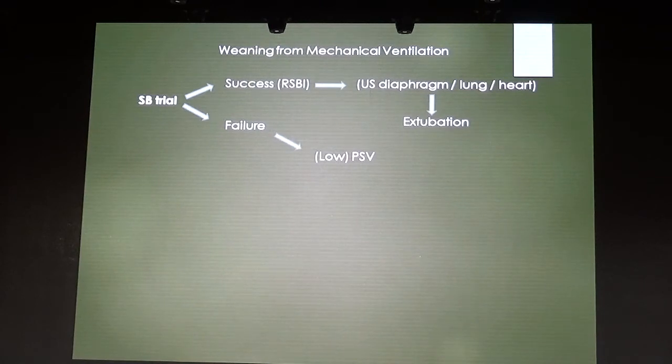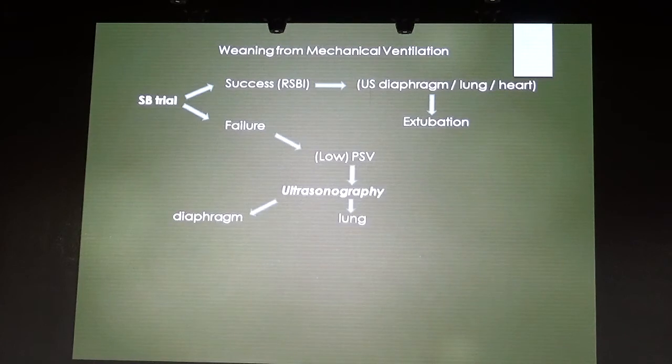So ultrasound should not be used as an index for weaning, as an extubation or intubation index. It should be used to understand what is happening. In my opinion, this is, of course, my opinion. This is not evidence-based, as I said. To understand what is happening to my patient who is failing the spontaneous breathing trial.